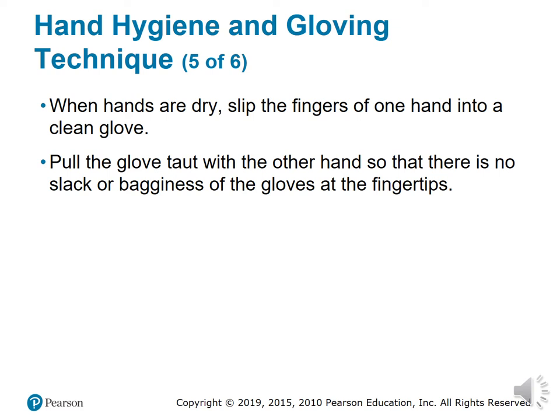You don't want to have any extra space in between your fingers and the gloves and the patient, because as you all see, when you go to tie the tourniquet, sometimes the excess glove gets caught up in the tourniquet. It makes it harder for you to identify the vein. So please make sure that you get gloves that fit. Typically at the school we'll have extra large down to small. We can order extra small gloves if need be. So please make sure that you have the right size glove on.